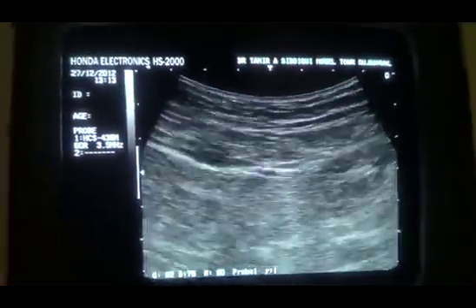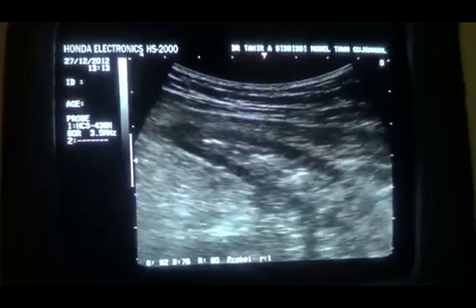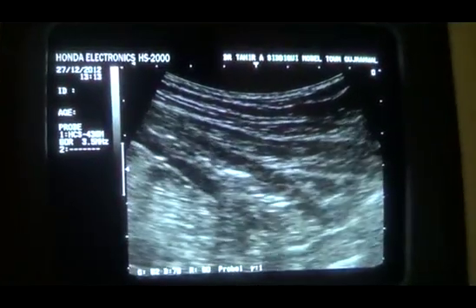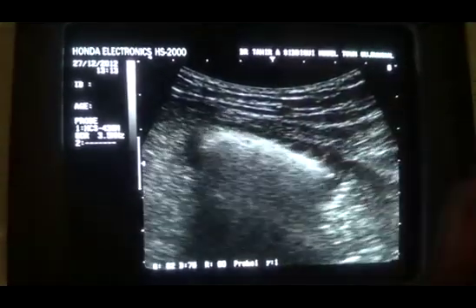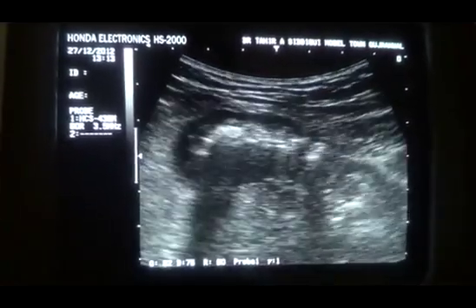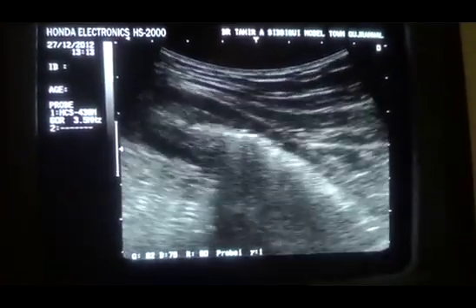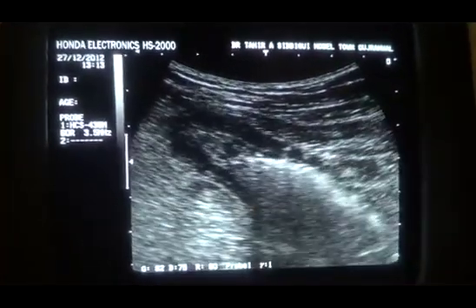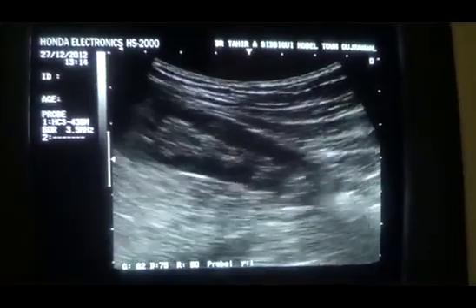This is the magnified view of the same bowel-related mass. You can see gas movement within this bowel segment. Inflammatory bowel disease is the probable diagnosis by ultrasound parameters. We have seen the bowel gas, the movement of the bowel mass, and the dirty shadow of gases travelling through the lumen of the mass.